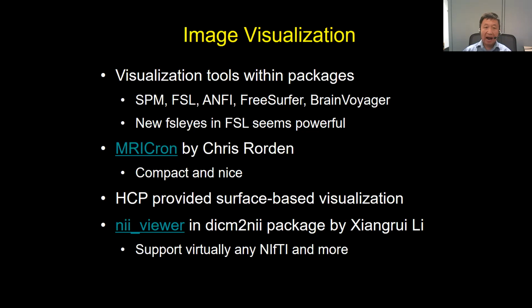That seems very powerful. Actually, the motivation for developing NIfTI view in Matlab myself was that FSLView in the older FSL version was really not nice. I think the major reason is that they tried to take care of the obsolete Analyze format, so the support for NIfTI was really bad. For my own purposes, I couldn't do a lot of things. That's one of the major reasons I tried to develop the visualization tool in Matlab.